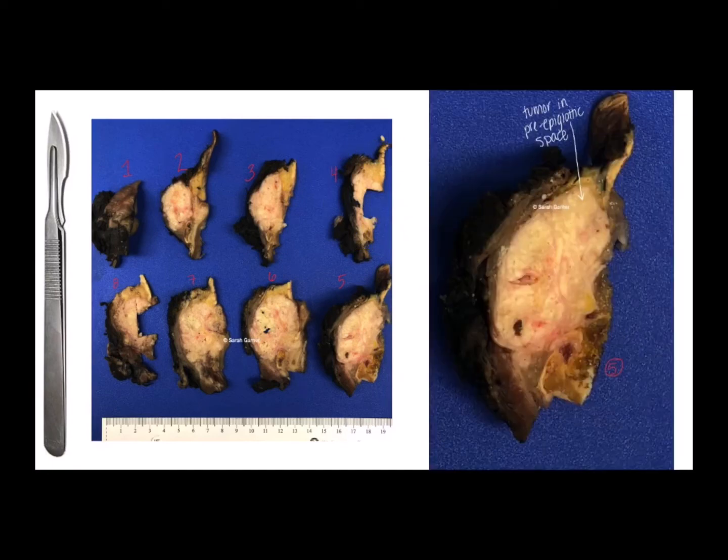Here's another one showing you that pre-epiglottic space. So this would be the epiglottis, cut here. And then this would be anterior to that. And it's pretty much obliterated all of the normal fat there. And you can also see it extending through the thyroid cartilage here. So this is slice 5 blown up here.